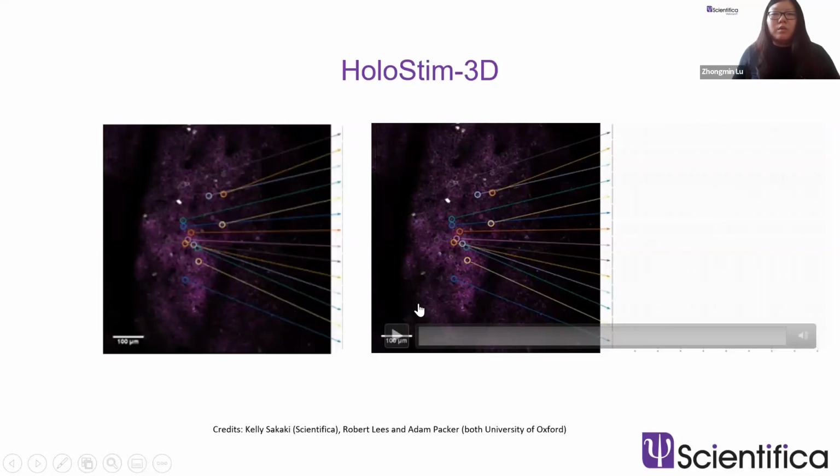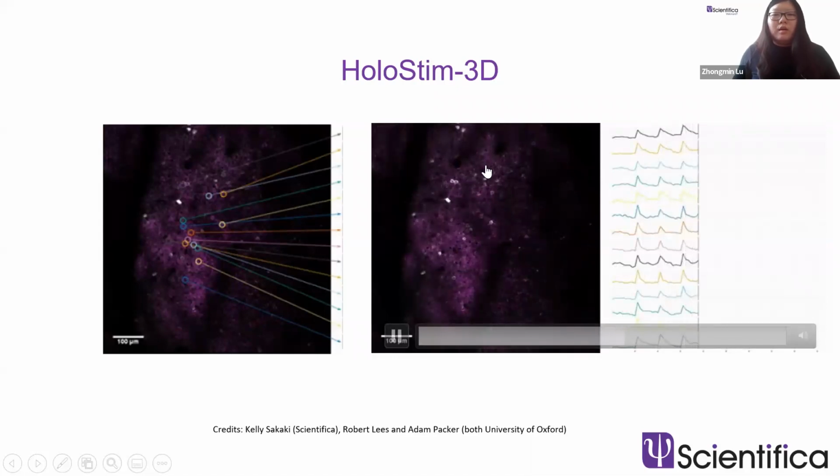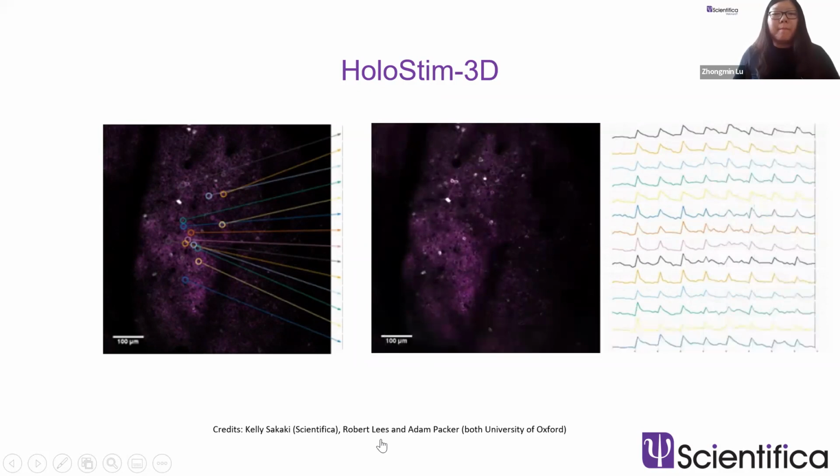But I also want you to pay attention to the neighboring neurons. They also have really interesting response patterns. So when the holographic stimulation simultaneously stimulates all these neurons, you can also see the neurons in the neighborhood light up and show really interesting response patterns.